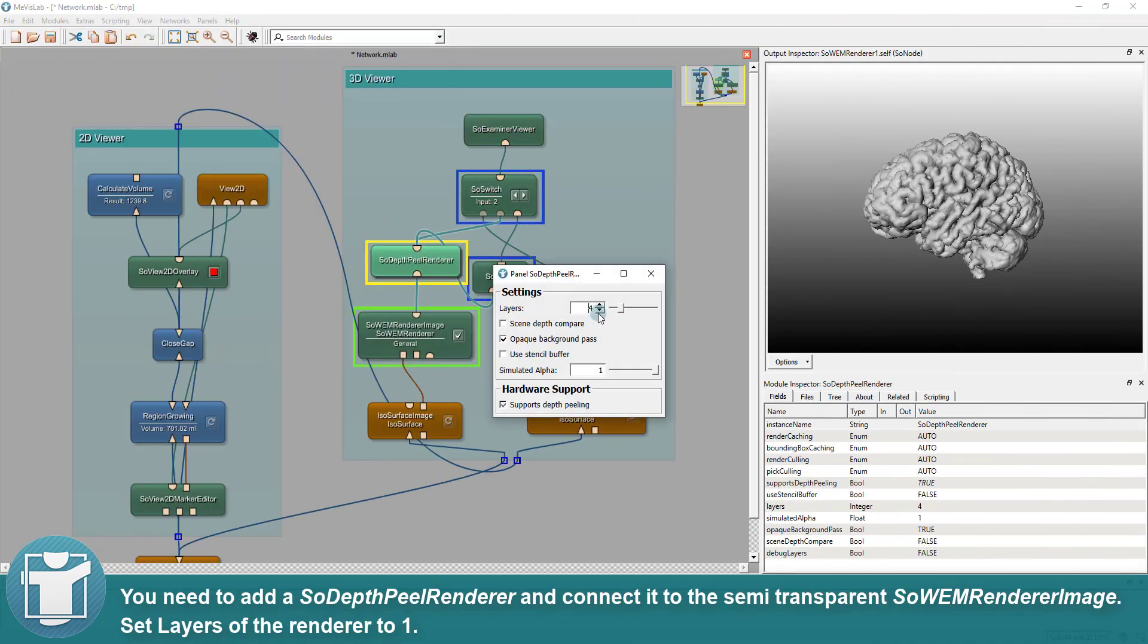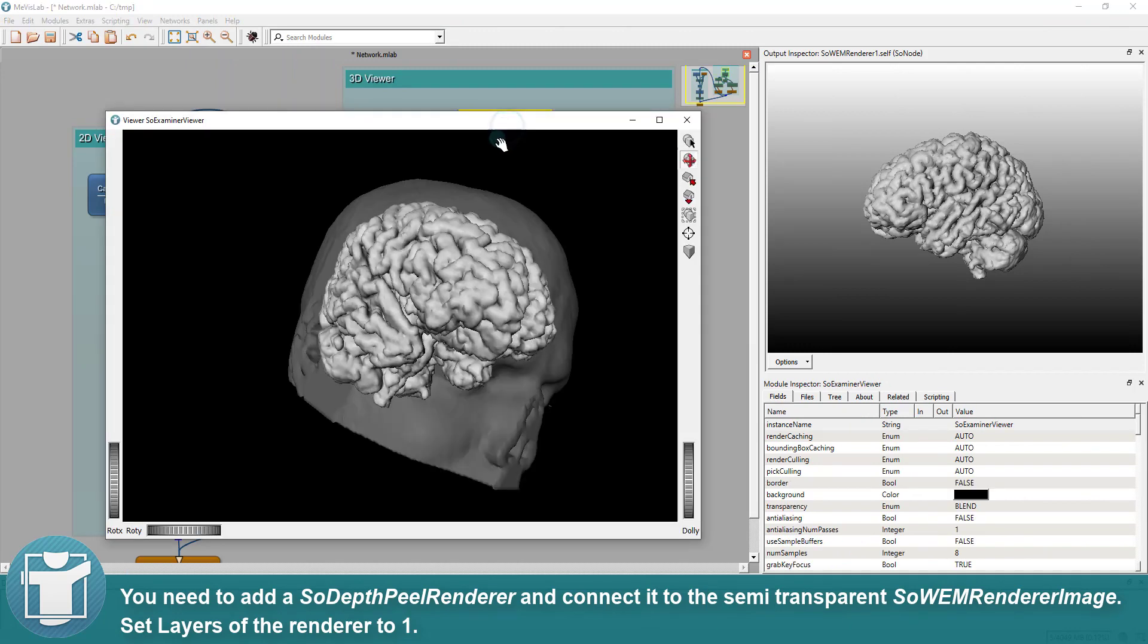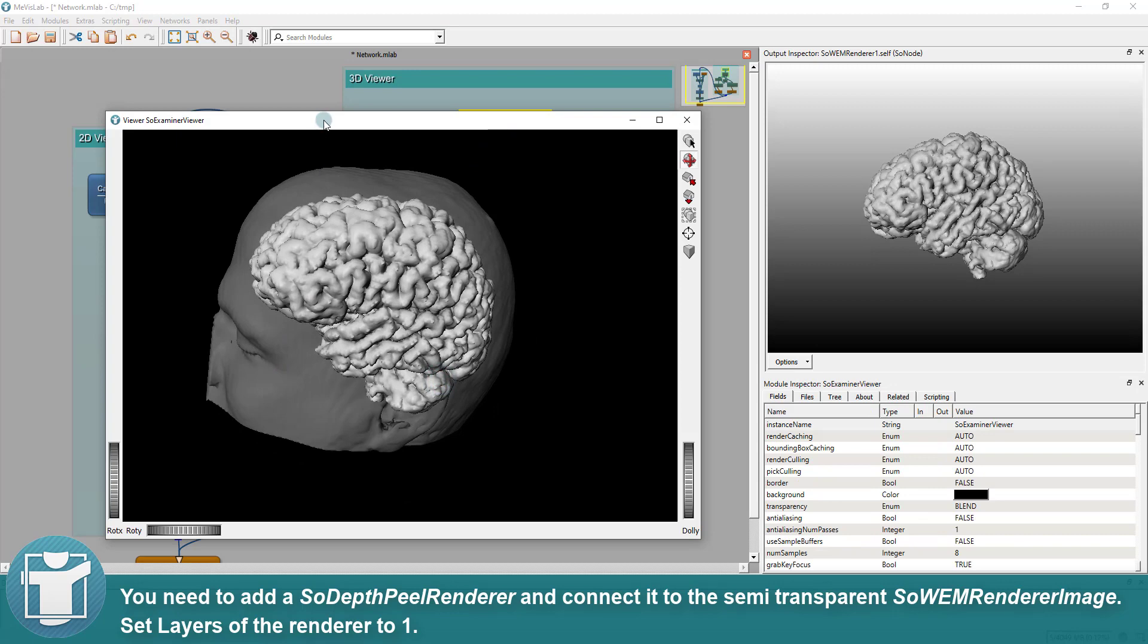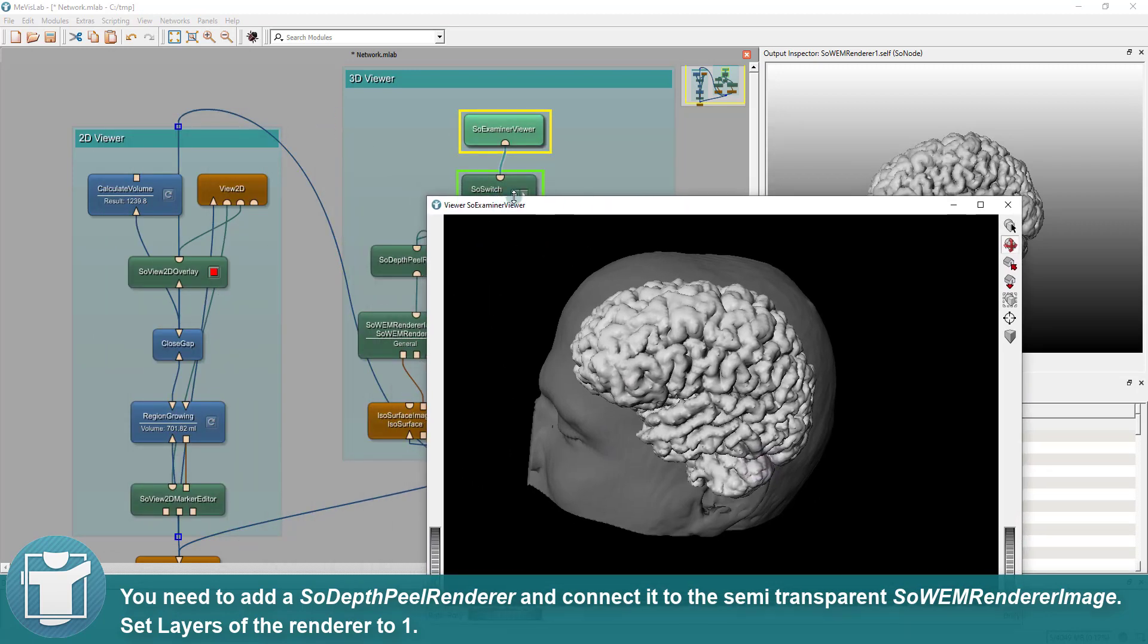Transparencies are difficult to render. You need to add a SoDepthPeel renderer and connect it to the semi-transparent SoWEM renderer image. Set layers of the renderer to 1.